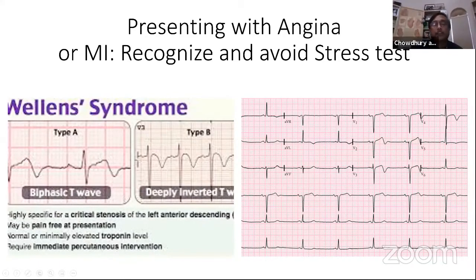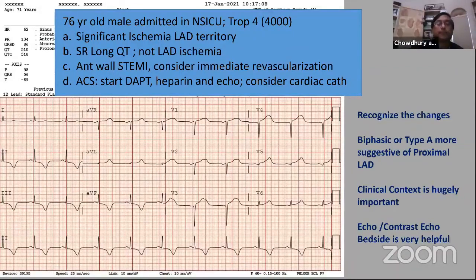And then this patient, I showed it before, those who did not attend last lecture, this is very deep T waves. Patient is in neurosurgical unit. In intracranial event, the patient has what we call subarachnoid hemorrhage, subdural hematoma, stroke. All this intracranial with long QT can give you this.